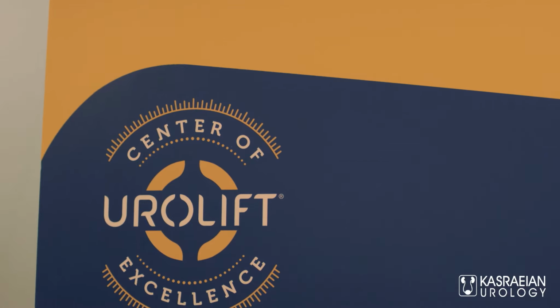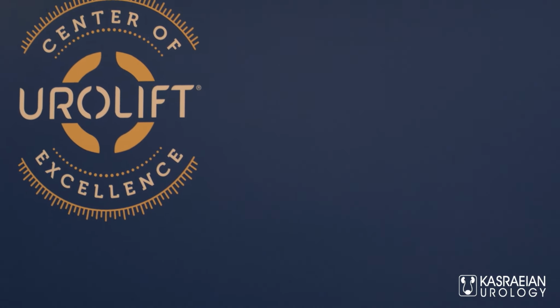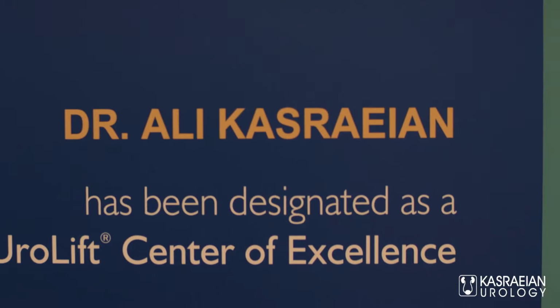The minimally invasive nature of the Urolift procedure allows us to do this both in the hospital setting under anesthesia, but also in the clinic setting under very minimal anesthesia. And we're using this with a combination of a prostate anesthetic and also nitrous oxide, and people can go home from our clinic after about a 30-minute procedure time, when really the Urolift itself takes about 15 minutes to perform.